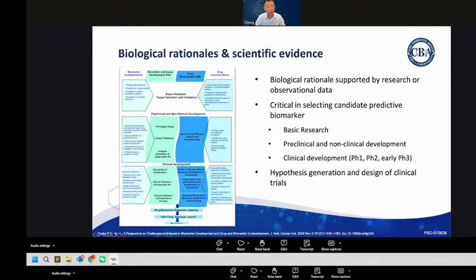And then the second practical solution, I think, is related to the biomarker. This is a particular case of when a biomarker is novel. Traditionally, most of the IHC assays already approved by the FDA are membrane-based, assessed by the pathologist manually, either under the microscope or using a computerized solution on the computer. So there's still manual interpretation of the stained images. However, when a biomarker is novel, instead of assessing the membrane staining, maybe other factors can be utilized.